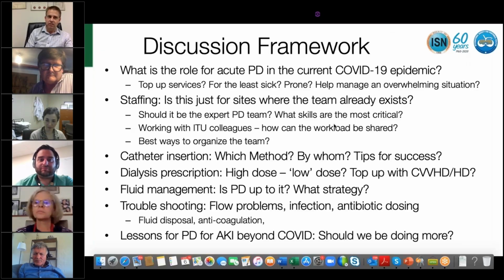I agree with Ladan's comment. The cytokine storm patient, the patient who's very hypercatabolic, with high lactates, those patients we struggle a little bit with. But the other part of it is that we worry because we see a creatinine sitting at 600-700, and we think, well, we're not getting enough dialysis because our CVVH machine gets the creatinine down to 120, 130.